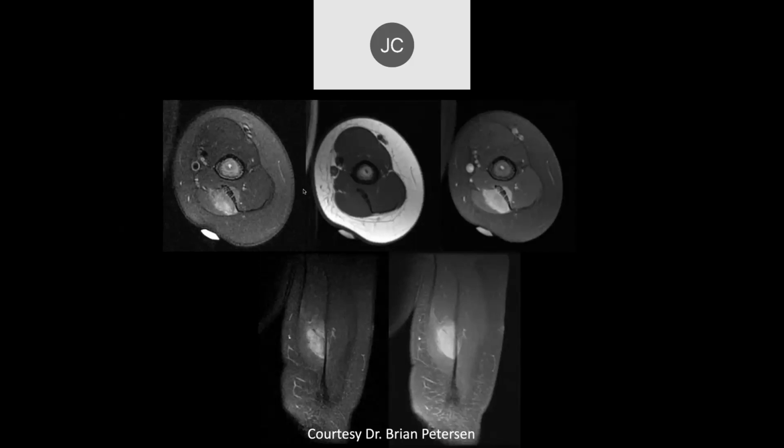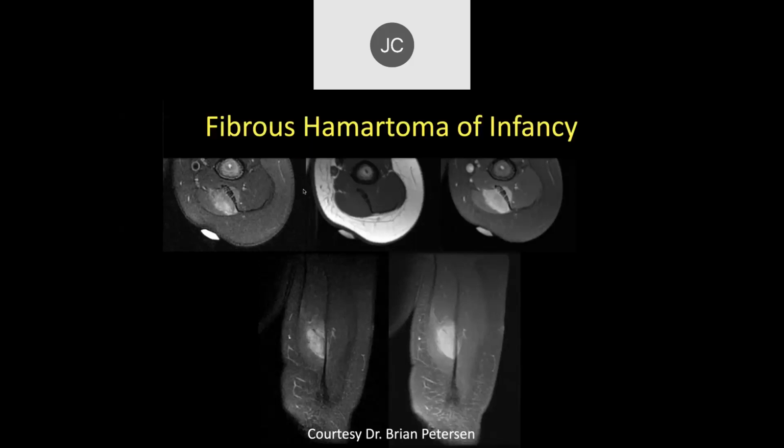Most of the people I know who deal a lot more with tumors than I have been burned at one time or another in the past when they try to rely on MR to make a tissue type diagnosis. So the more they're in this field, the more they get aggressive with doing biopsies to get actually a tissue diagnosis.